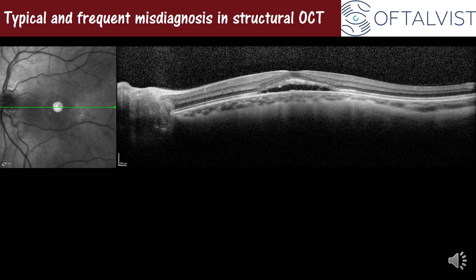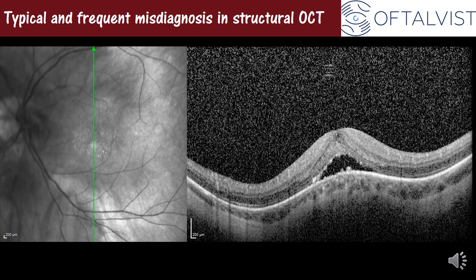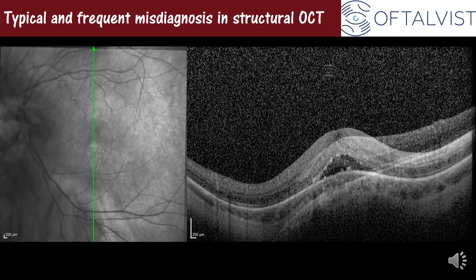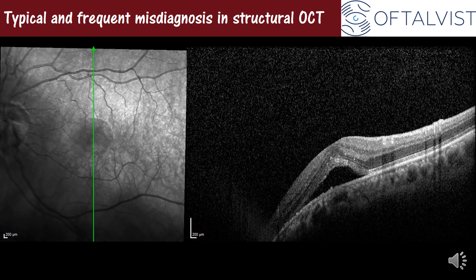It is also very frequent to receive patients with the presumed diagnosis of CSC like this. You can see the tilted disc, the abnormal contour of the posterior wall of the eye, and the presence of subretinal fluid. These cases with tilted disc and serous macular detachment in a configuration similar to dome-shaped macula are the most frequently misdiagnosed as central serous choroidopathy, and obviously they have nothing to do with the pathology or the therapeutic approaches to that disease.